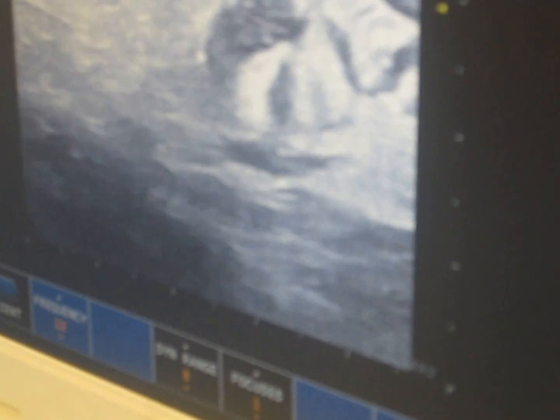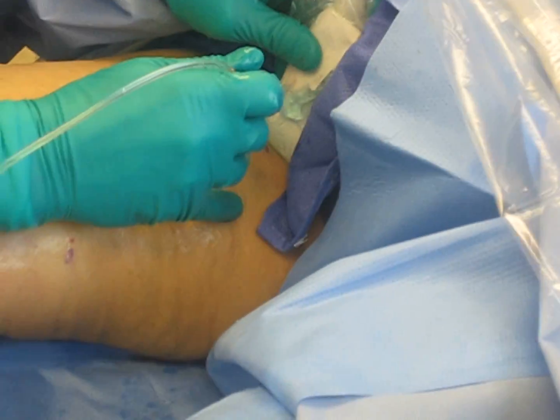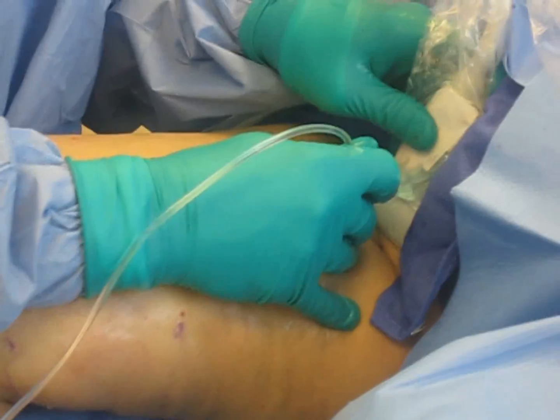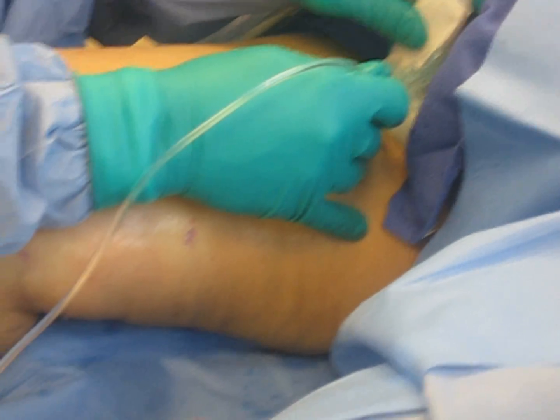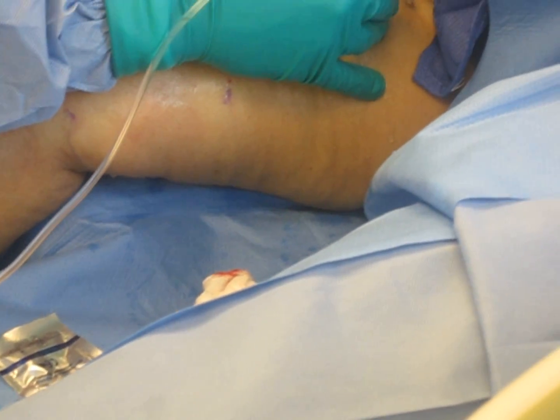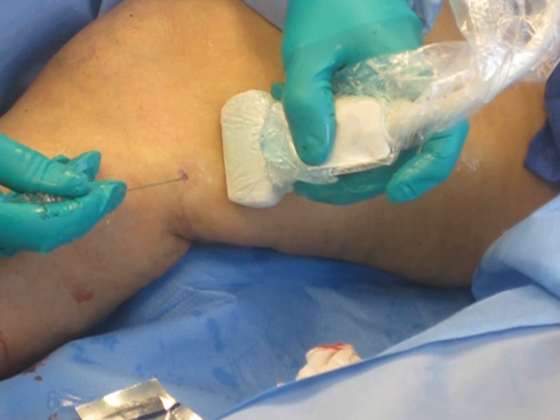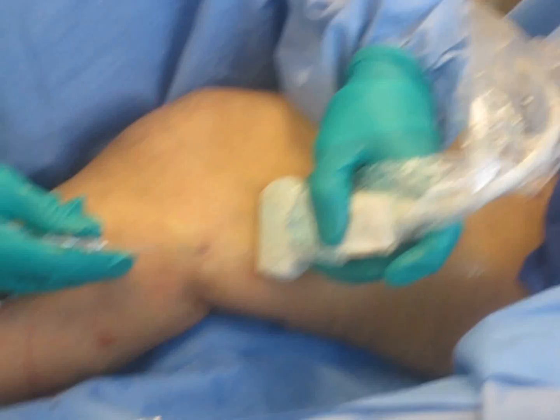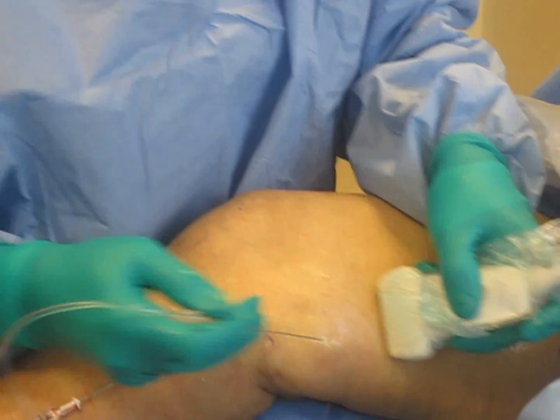What we're doing here is pumping what's known as tumescent anesthesia. Tumescent anesthesia is a very diluted anesthesia, and it was invented by a dermatologist, Klein, for liposuction. You pump it in and then actually aspirate a lot of it as you're pulling the fat out — but that's not what we're doing for this patient. She has a great saphenous vein that emerges from the compartment in which the vein usually stays, so I have to push it down a little bit from the skin to avoid any issues.